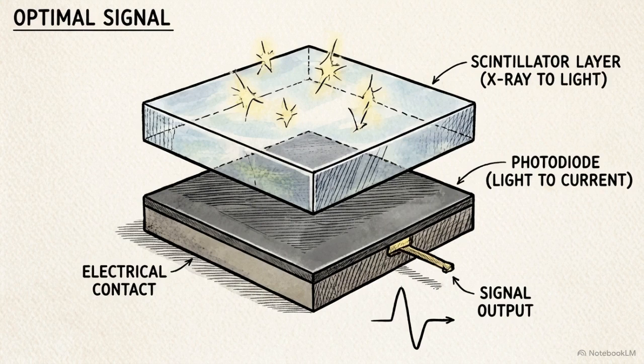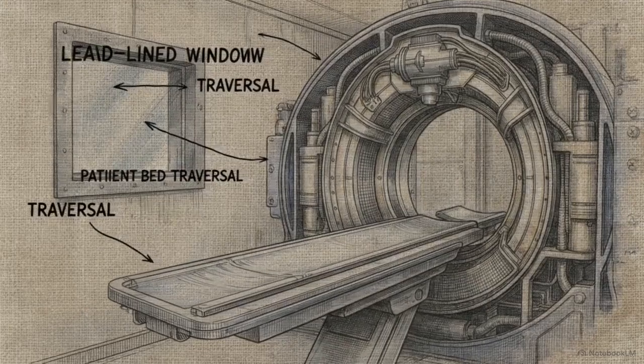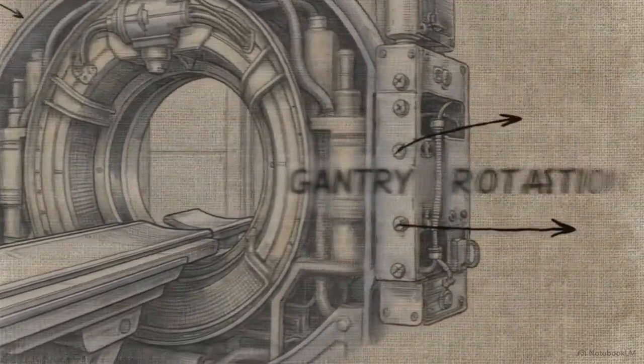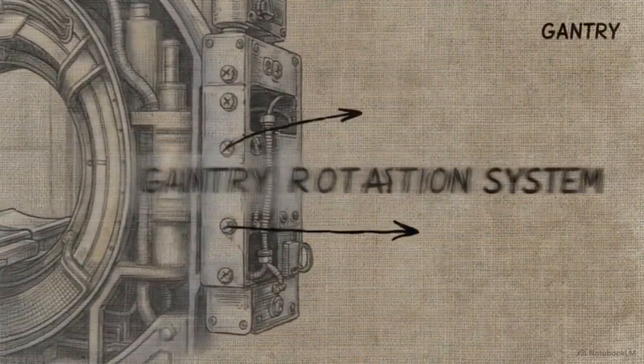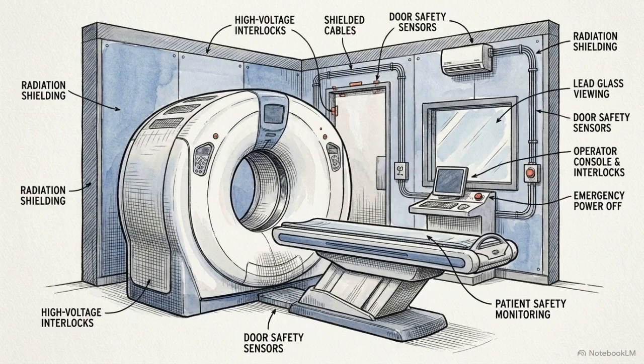The SSD provides three major operational advantages: an exceptional 90% detection efficiency, extremely narrow gaps between active elements for high geometrical efficiency, and a tiny physical footprint. If multi-slice imaging still operated at a 50% capture rate, the required radiation exposure to achieve a high-resolution scan would be prohibitively dangerous. The 90% efficiency of solid-state detectors is the core reason modern CT is clinically viable.